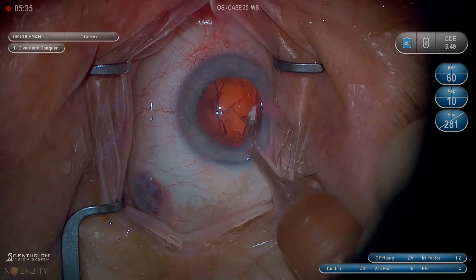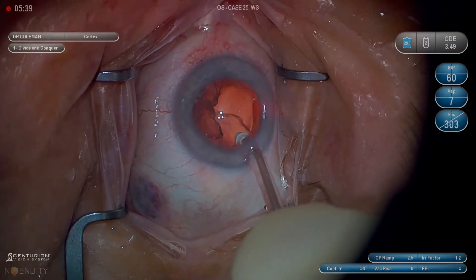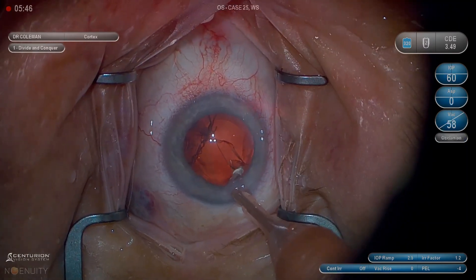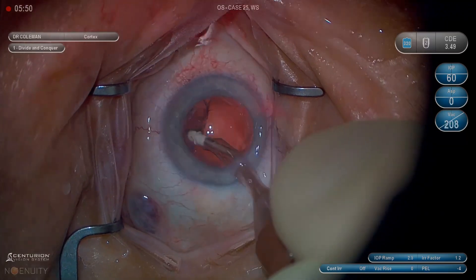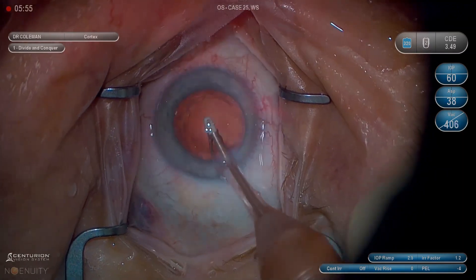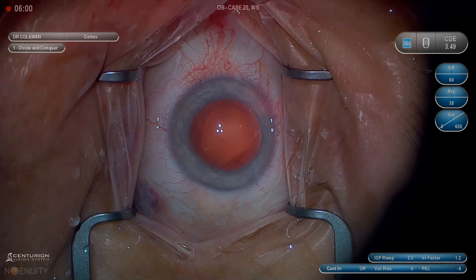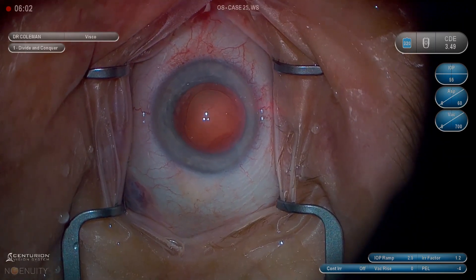A general principle: if you're looking straight down the bore of your port — if it's not tilted at all to either side — it's very rare to see posterior capsule come into that. Be careful when you're pointing the port down or to the side, but when it's facing vertically up on the visual axis straight towards you, it's very hard to engage the posterior capsule, and you can be more aggressive with the foot. You're usually going to engage with it pointing to the side or down, but make sure you're looking straight down it when you add a lot of foot to take that cortex. Hope this is helpful — this is five of six, and the final one's coming up next, so make sure and watch it. Thanks.